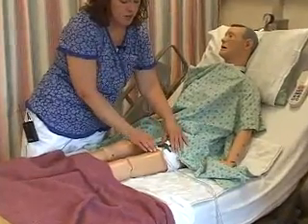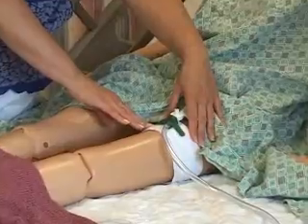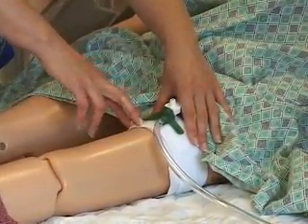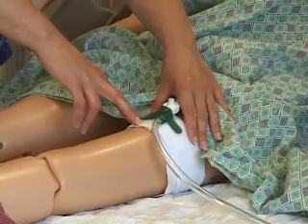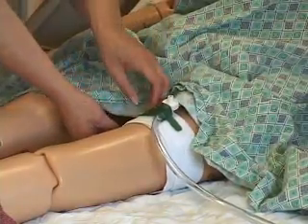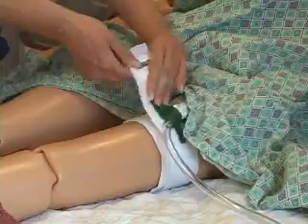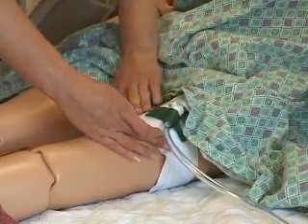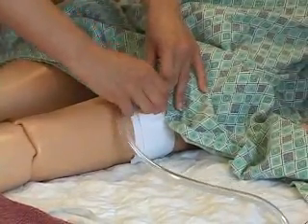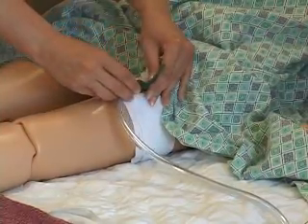This is the leg strap that is used with your nighttime drainage bag. It's a Velcro strap that goes around your upper leg and should fit snugly but not too tightly as to not cut off your circulation. But you don't want it to be able to move freely on your leg because that could cause pulling and trauma as well. The attachment is very simple, just with Velcro to fit around your leg. The catheter tube holder is also Velcro and fits snugly around the drainage tube to help keep the catheter in place.